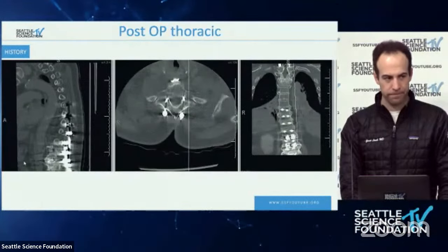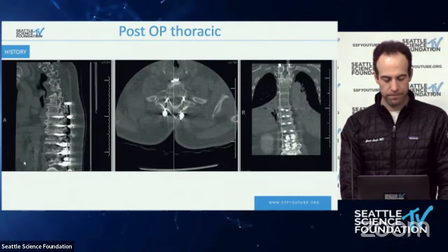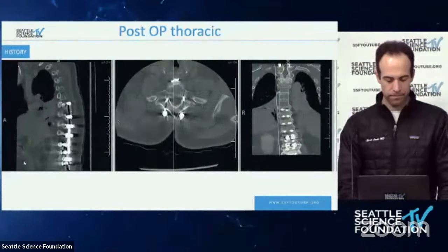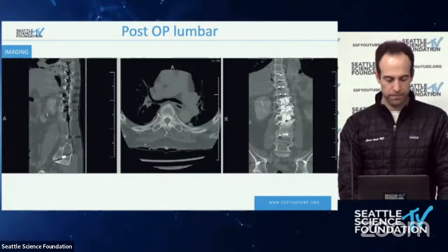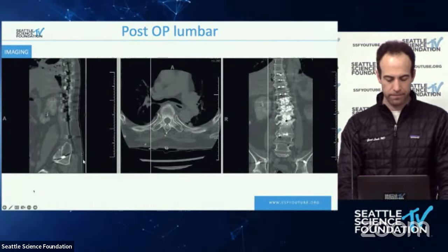We worked very hard on getting an intradiscal osteotomy going with expandable cages and all and full releases, and we could not get him cranked out as far as I wanted to. I think we got him much better, but Rod, any thoughts? I mean, I think one of the things that wasn't brought up is the preoperative course. I think this guy was seen for 2 years.